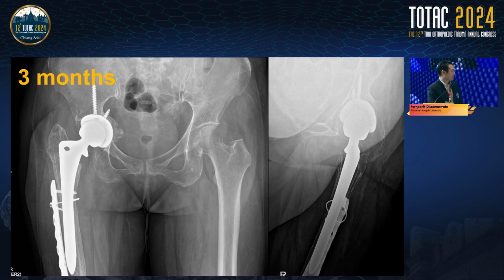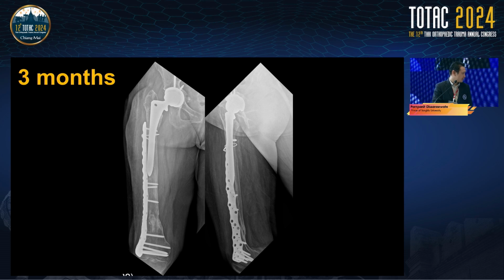And this is three months later. The fracture shows increased consolidation at the distal part, and we hope it heals nicely. Thank you.